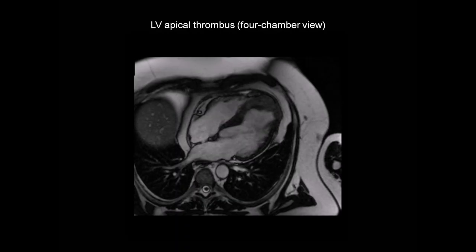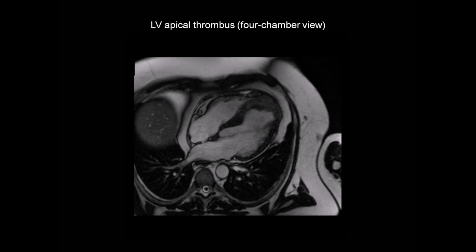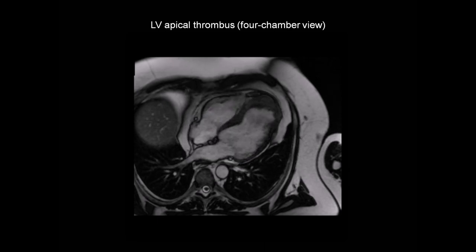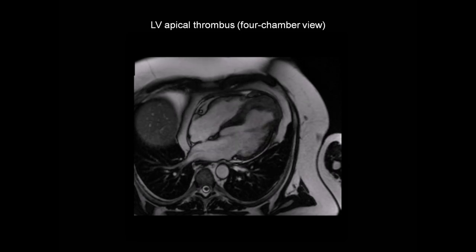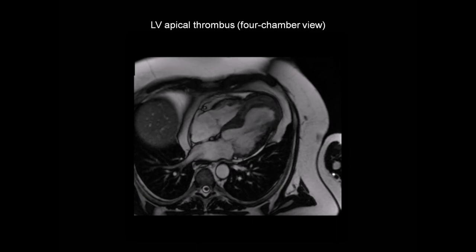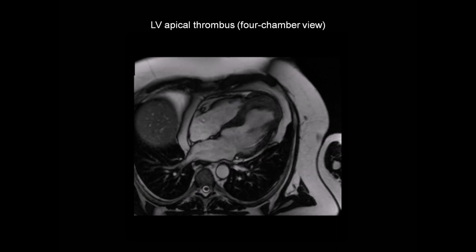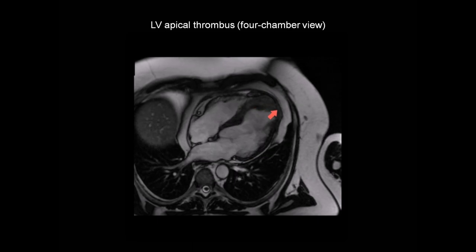This is a cine-CMR image showing a four-chamber view, from a 47-year-old man with an ischemic cardiomyopathy. He has an overall left ventricular ejection fraction of 36% as a result of a significant area of myocardial infarction affecting the left ventricular apex. This is the left ventricle, and we can see that the apex is dyskinetic.